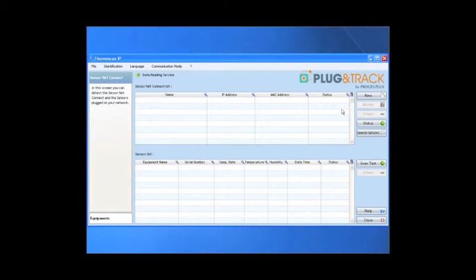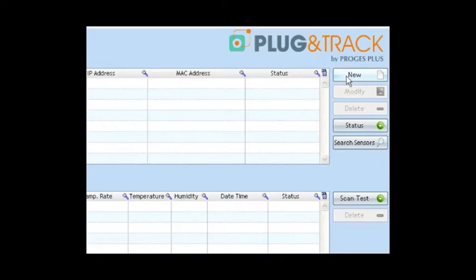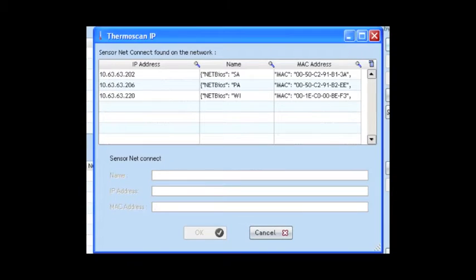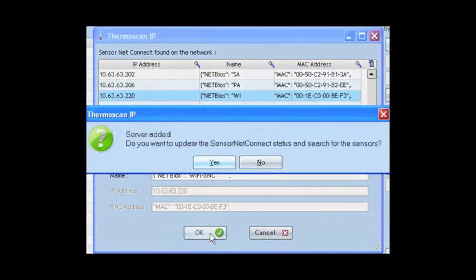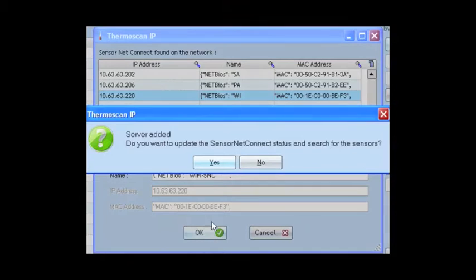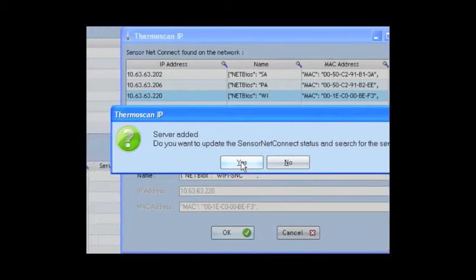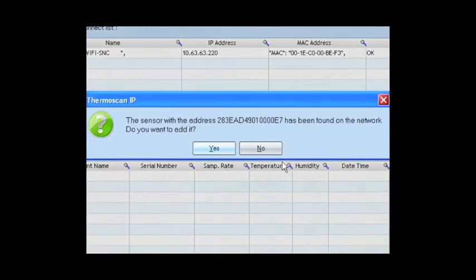Installing probes is very easy. Thermoscan IP can find new sensor netconnect automatically. It will also find the new sensors.